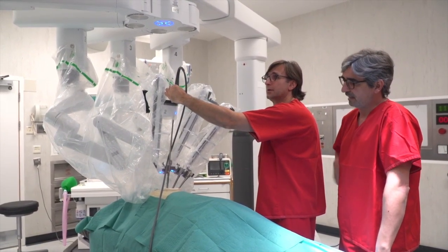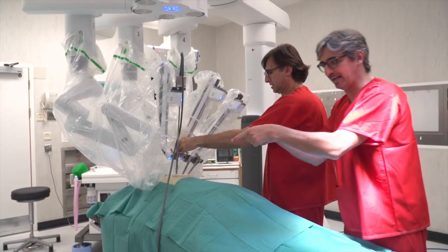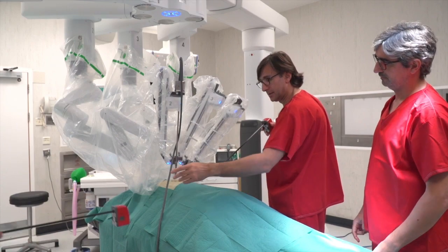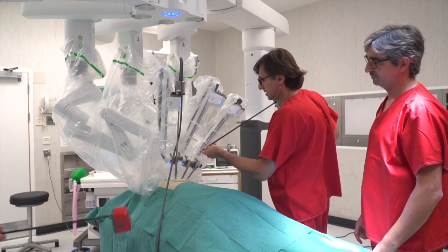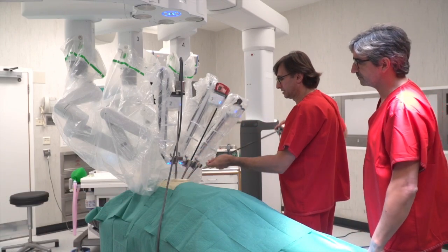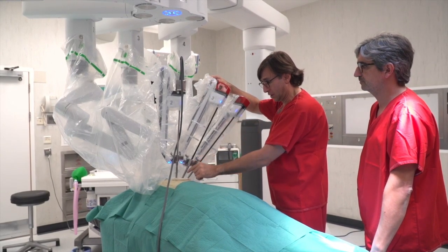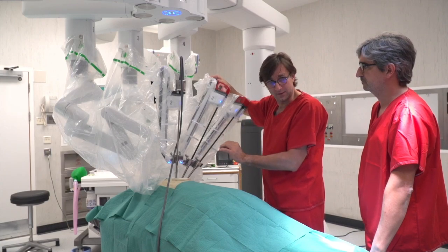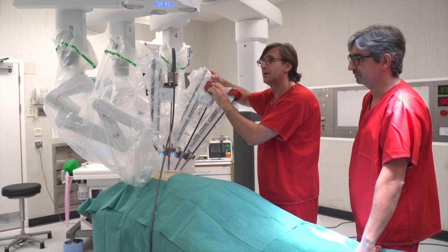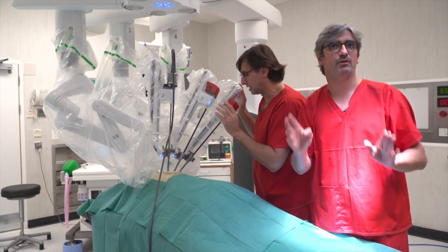Searching for the target — camera in the other part? Yes, always. This is a very important concept. The instruments are below, parallel — not like this, parallel. My left arm is a pro grasp, arm number three, and the right arm is the Maryland dissector. You also use the direct vision for positioning — it's important, the screen and the direct vision. Because you have a utility incision, so you can see through the incision to put the arms.